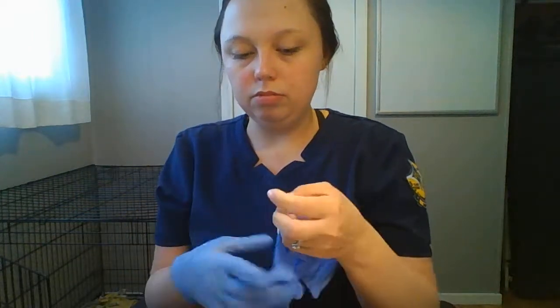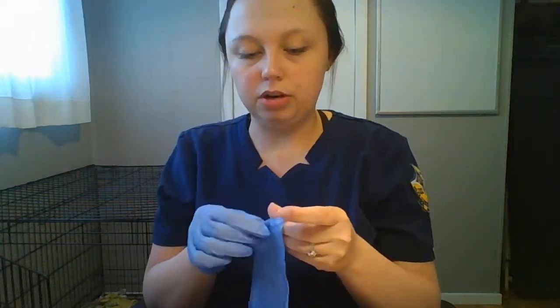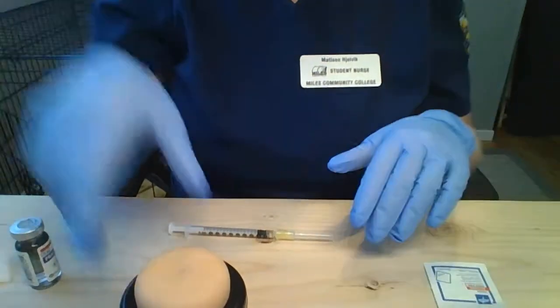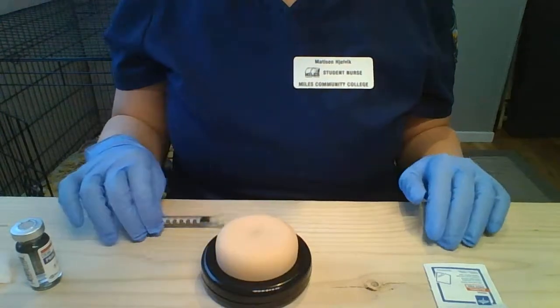Wash my hands. And then I'm going to put on some gloves and explain to the patient that we're going to be doing an injection for a tuberculosis test. I would also check the patient's allergies, which my patient is allergic to Celebrex. So it's important to make note of your patient's allergies. I'm going to push this back down to be able to see. Okay.